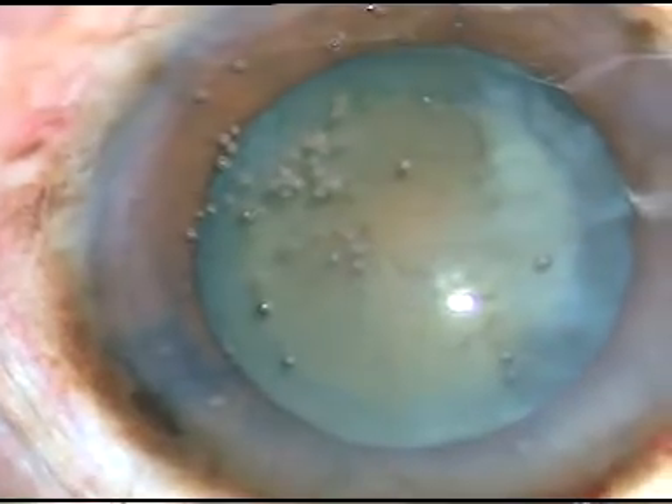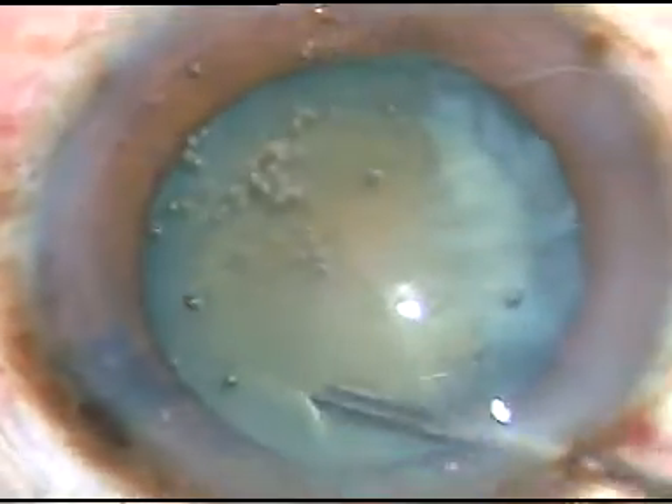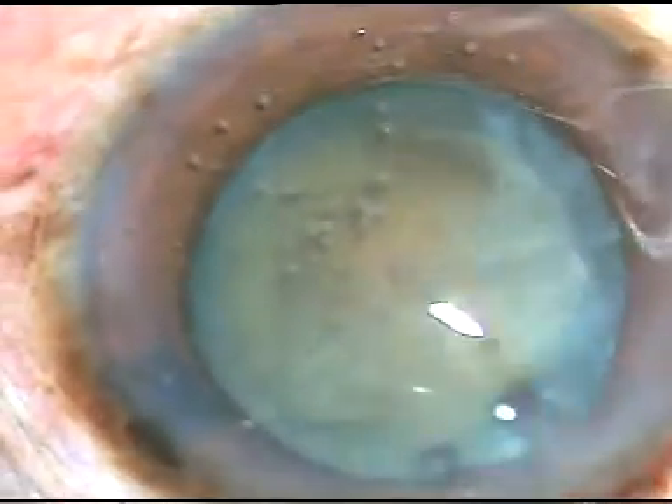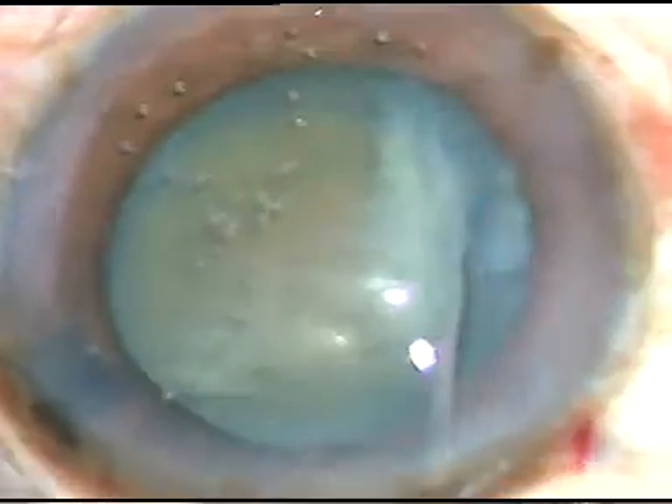Then I take a 27-gauge cannula and pass a fluid wave between the capsule and the lens matter, to decompress the lens matter so that the fluid trapped behind comes forward.